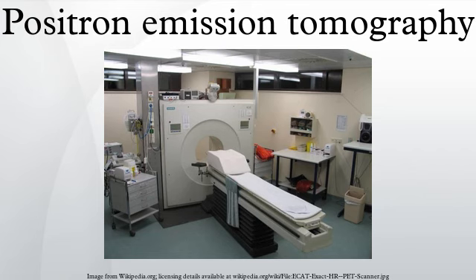Iterative expectation-maximization algorithms are now the preferred method of reconstruction. These algorithms compute an estimate of the likely distribution of annihilation events that led to the measured data, based on statistical principles. The advantage is a better noise profile and resistance to the streak artifacts common with FBP, but the disadvantage is higher computer resource requirements. Recent research has shown that Bayesian methods that involve a Poisson likelihood function and an appropriate prior may yield superior performance to expectation maximization-based methods which involve a Poisson likelihood function but do not involve such a prior.